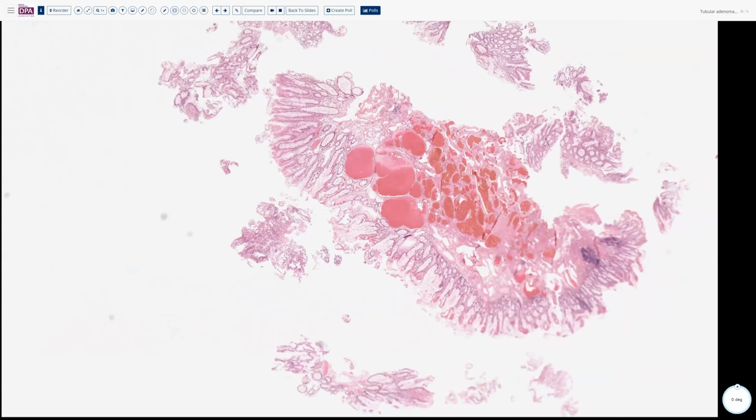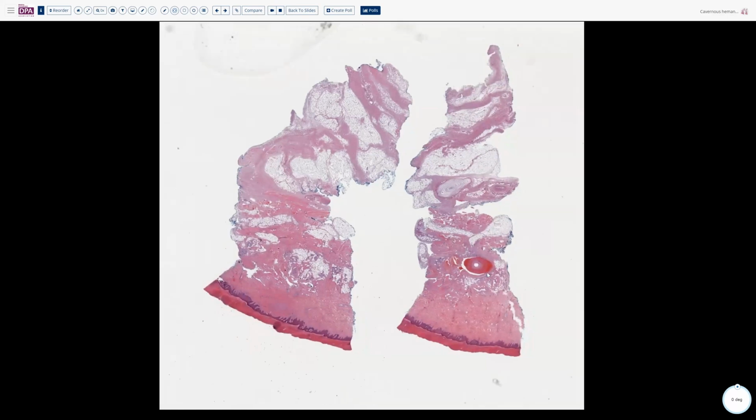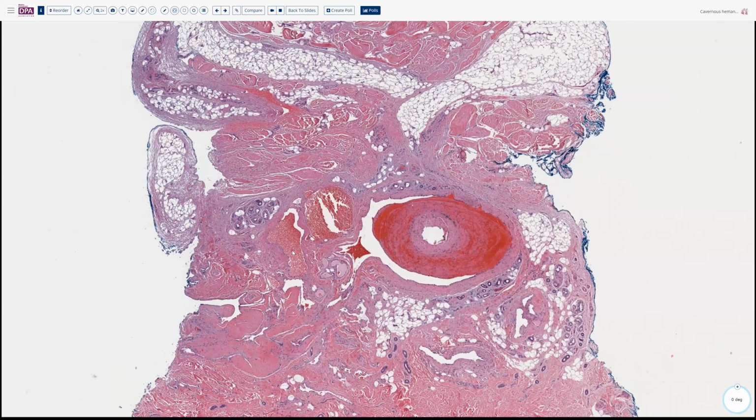And they extend up into the mucosa, as well as involving the submucosa area here as well. Here's an example from the skin. This one associated with a bit of a clot. And here you see the remainders of the other portions of this. Very thin walls, no capillary bed associated with it.